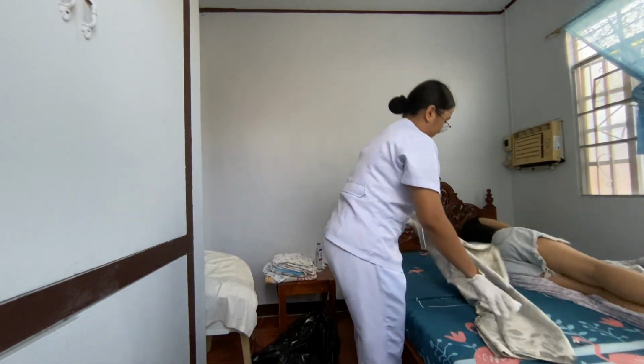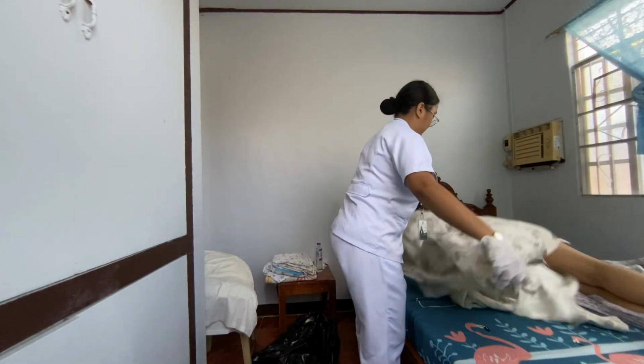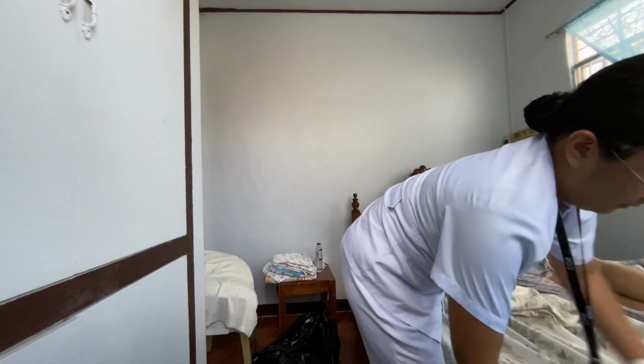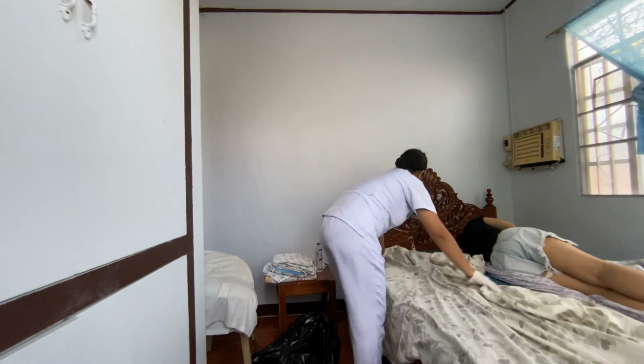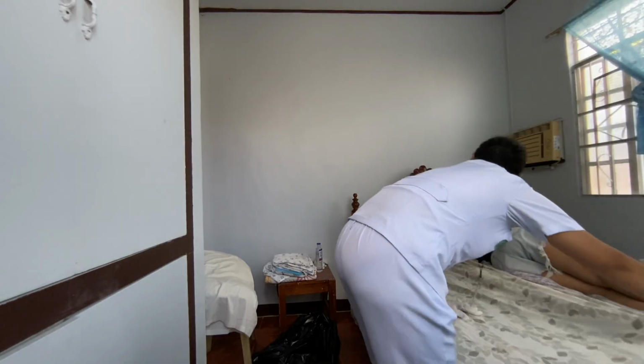Place the clean bottom sheet on the near side of the bed with the center fold aligned to the mattress. Fan fold it to the center under the old linens, then secure it over the head and foot corners. This reduces stain, ensures proper coverage, and makes linen removal easier.